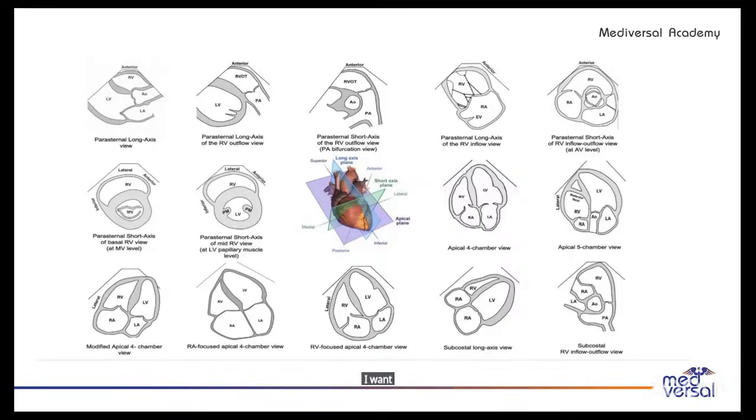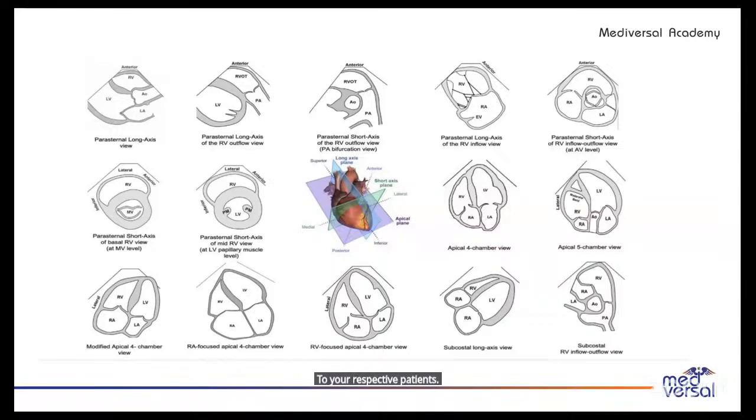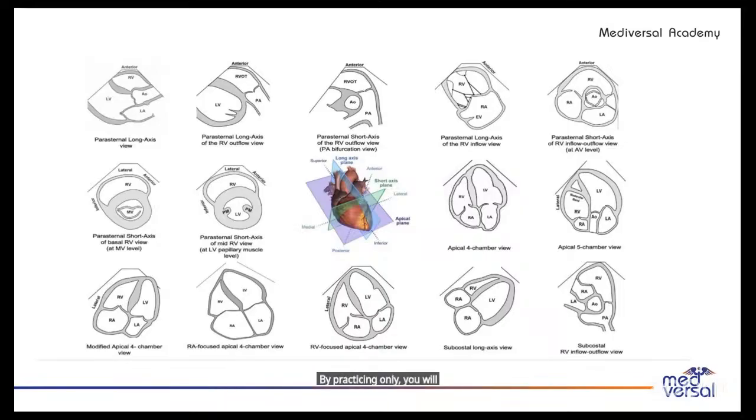I want you to learn the basics in the assessment of the right ventricle. After my class, you have to go to your wards or respective patients. Kindly practice it. By listening or by studying, you may not get it. You have to practice on patients. Slowly you'll get the views first, and then all these things. Only by practicing will you get all these measurements.